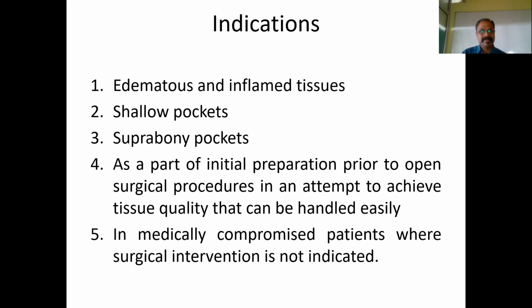So what you do basically in that situation is a supragingival PMPR first, followed by a subgingival PMPR. Along with the root planing, you are going to debride the root surface. Then you are going to do a curettage along with that. That is going to eliminate most of the shallow pockets and revert the sulcus depth to near normalcy.